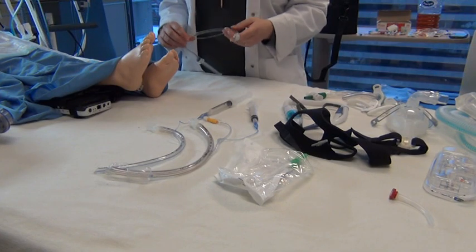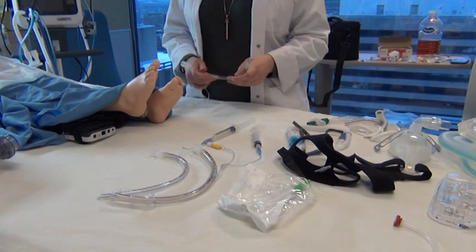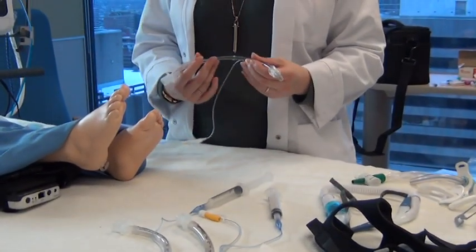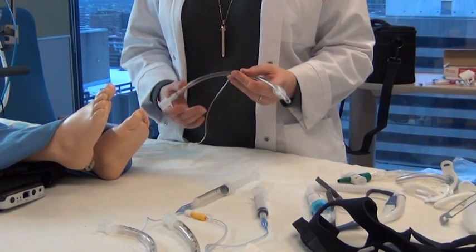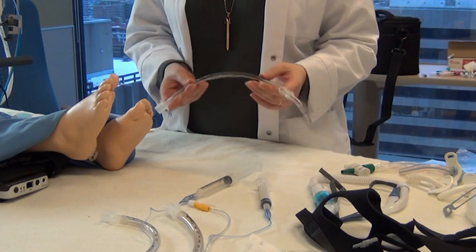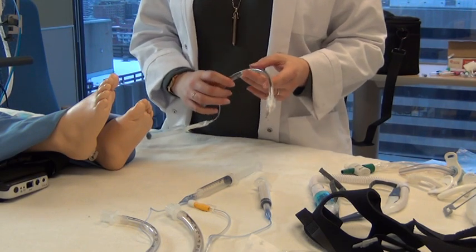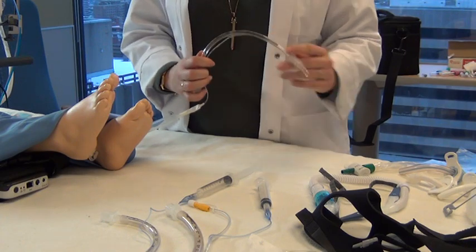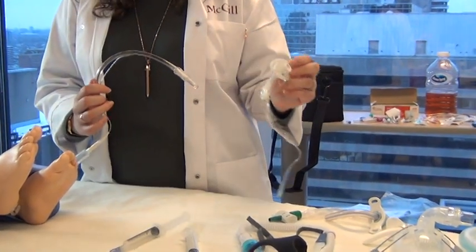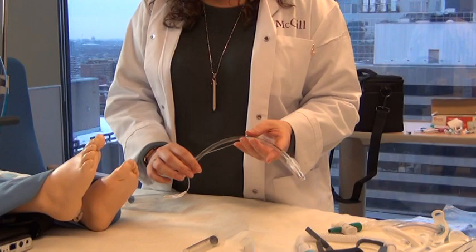Talk about mechanical ventilation. The first thing that we'll discuss is that with ventilation there's non-invasive and invasive ventilation. We'll start off with invasive ventilation, which is likely what you've seen more of in movies or TV, generally speaking. So we provide invasive mechanical ventilation through an endotracheal tube. The other option is providing it through a tracheostomy tube. But we will start with an endotracheal tube for the moment.